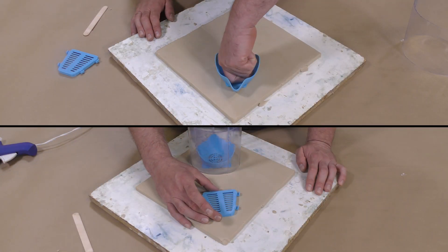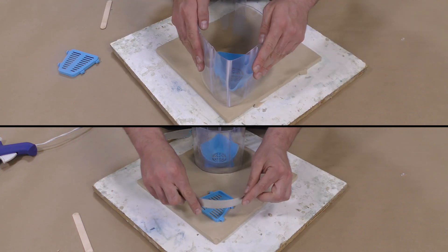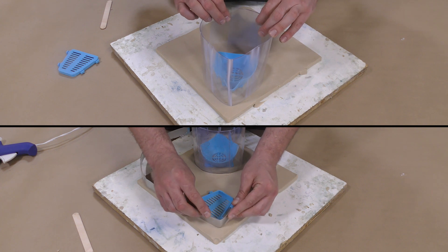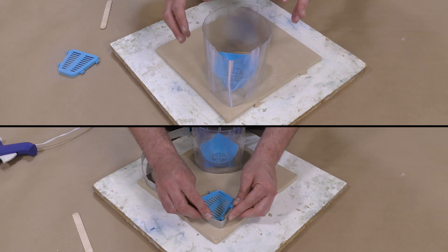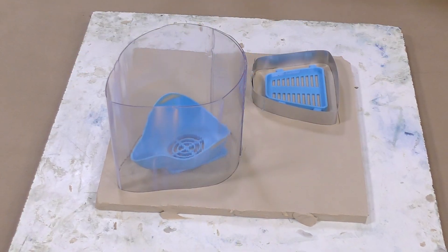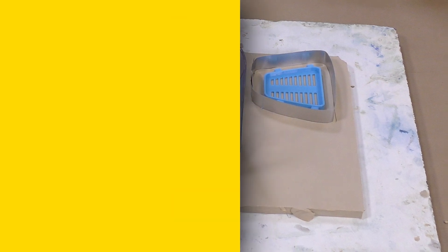Once the model is prepped, we're going to position it onto the clay bed that we set up and press it firmly into that clay bed. Then we're going to put a surrounding mold box around it. Here I'm using some plastic sheet on the left and then aluminum sheet on the right for the smaller part.